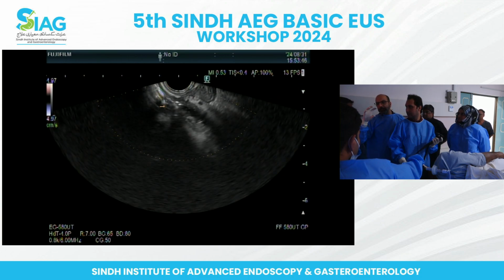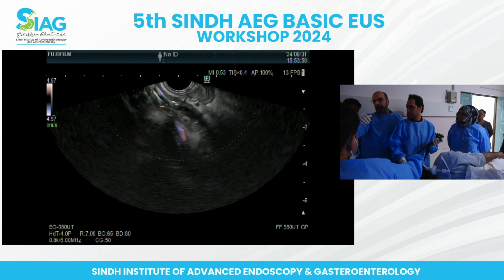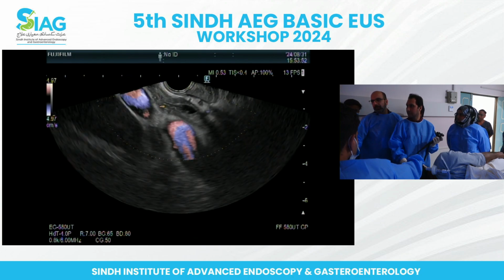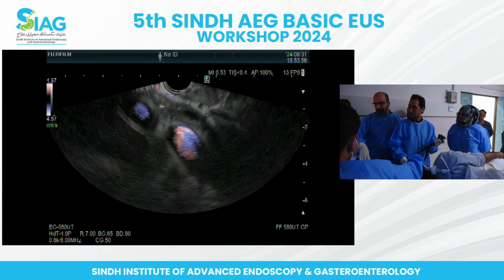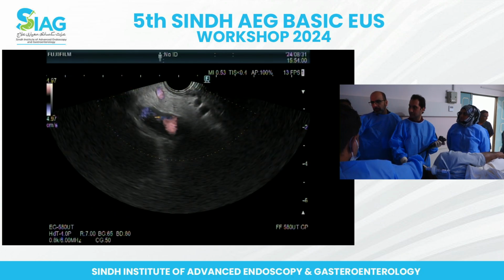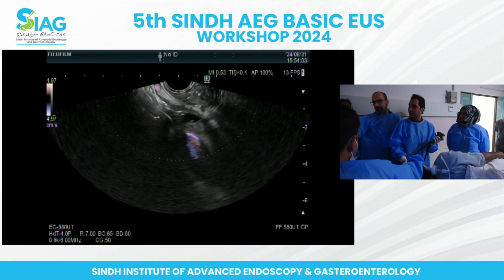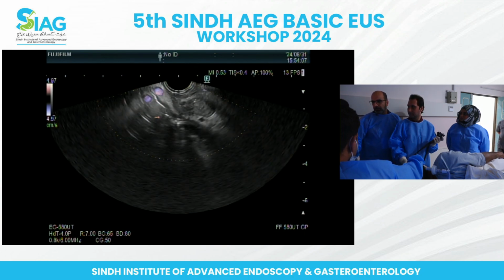So once you find the portal vein, usually you have to push forward, relax your big wheel, and that'll take you towards the bile duct. Now if you go counterclockwise, you'll go towards the liver and maintain this structure, which is your bile duct. So if you lose it, then you have to go back to it and do something different. So relax your big wheel and go counter.